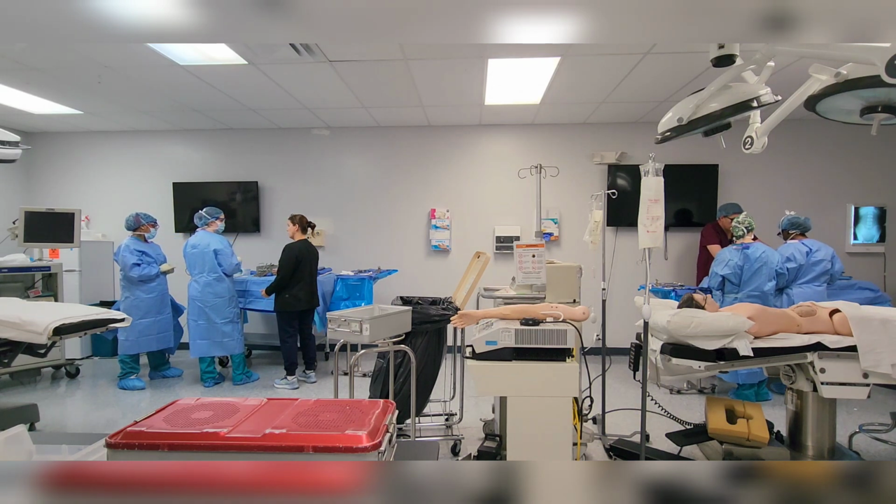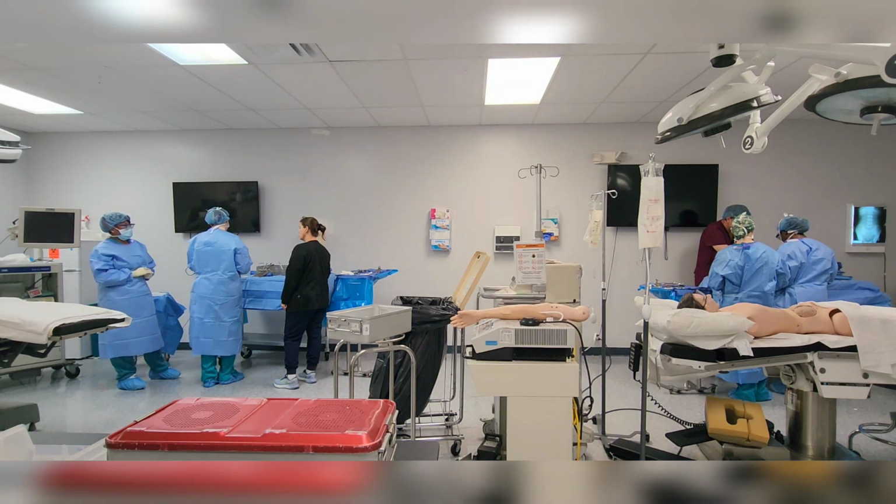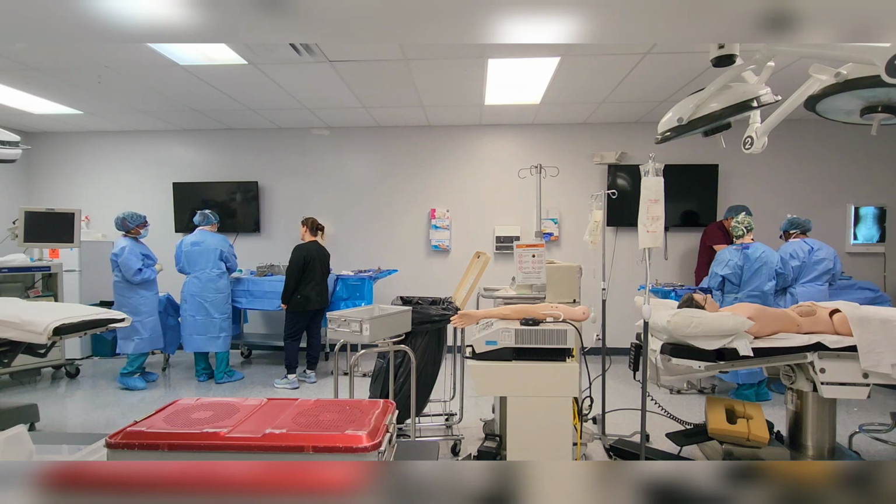If they take out a specimen, then I would just have this. They might measure it because they need to know the margins. The other thing they might use it for is to measure the incision. Sometimes, if we're doing a specific type of dressing, they might need to measure that incision.